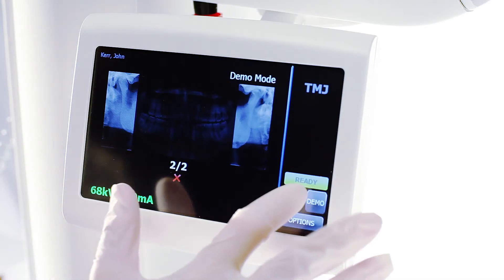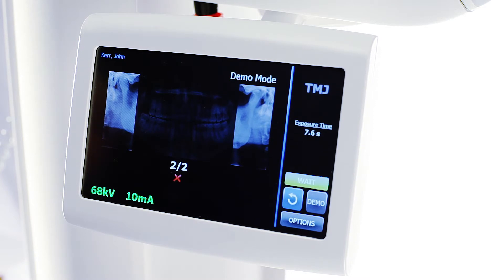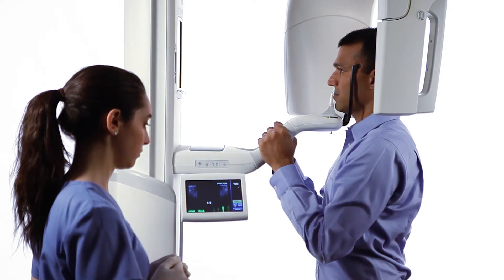Again, enter the ready for imaging position by tapping the cycle button once and verify the green ready condition. Ask the patient to fully open the mouth, remain still, and hold their breath for the duration of the scan. Perform the second scan of the TMJ examination.